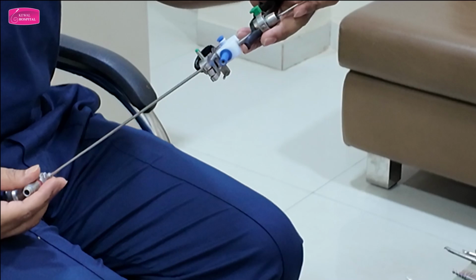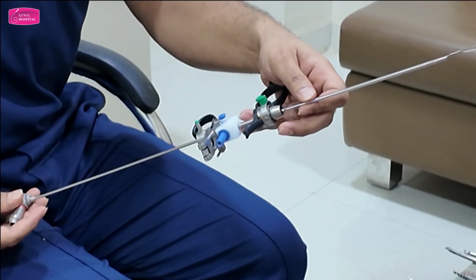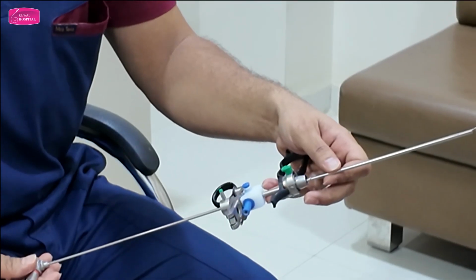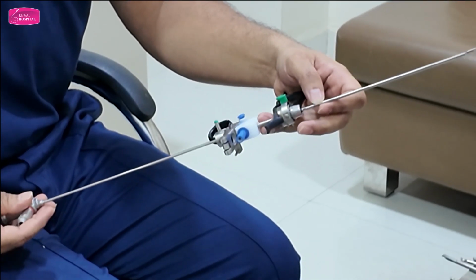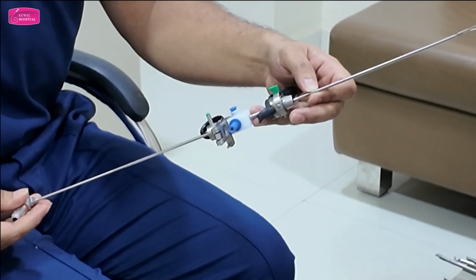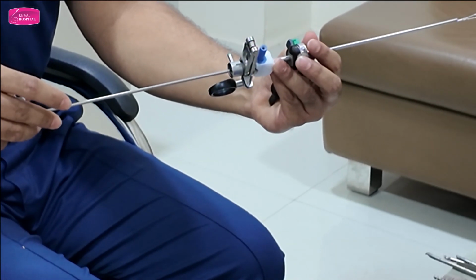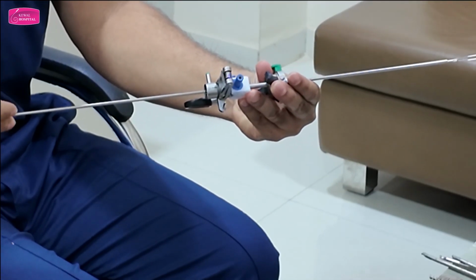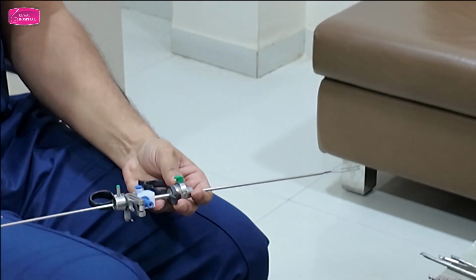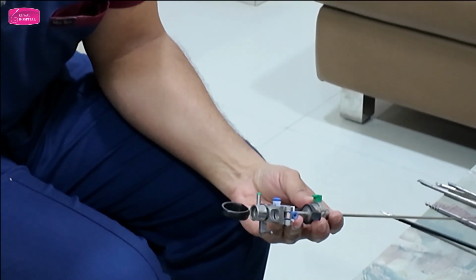This is very important to understand. If you push it forcefully, scope can hit this and get damaged. So that is why it is very important for you to align the scope properly. Understood? While inserting. So these things are to be done very, very carefully.